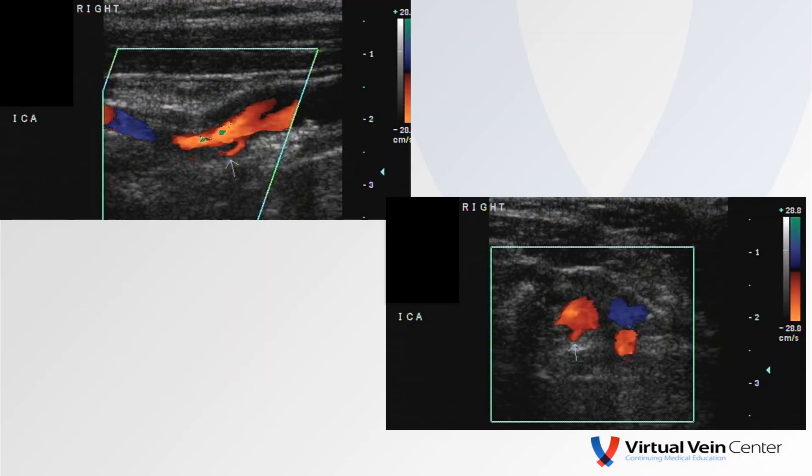This isn't the patient I did last week — this was actually from a good many years ago. I'm scanning this patient's mid to distal ICA and I see what appears to be a branch. One of the first things I do is turn transversely to ensure that branch is off this ICA and not just another artery coursing close to it. I can see it both longitudinal and transverse.